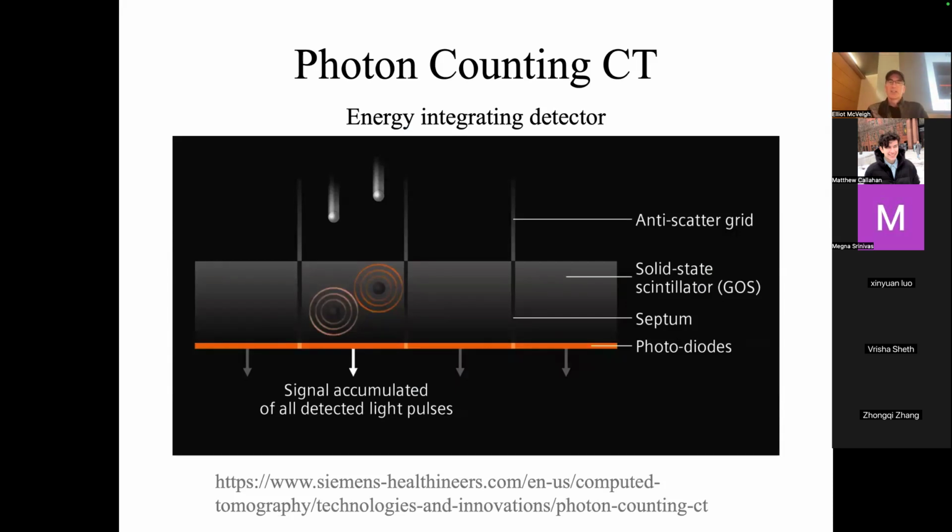So what do the detectors look like? If we have basically photons coming in and we want to detect where they are, you can think of it as a camera, right? I have a two-dimensional array of detector elements, and the photons are going to come in and hit those elements and make a two-dimensional picture, right? Each element traditionally looked like this.